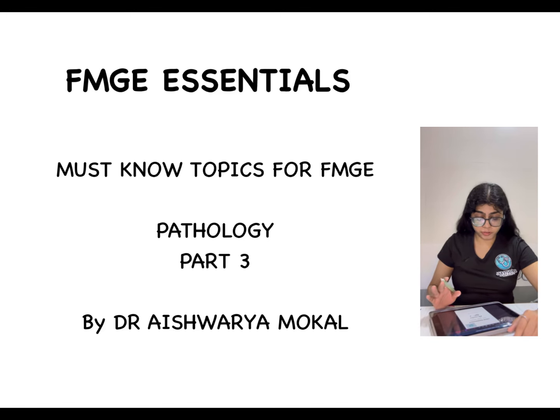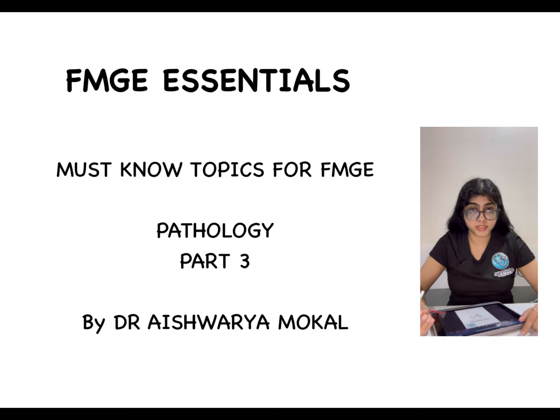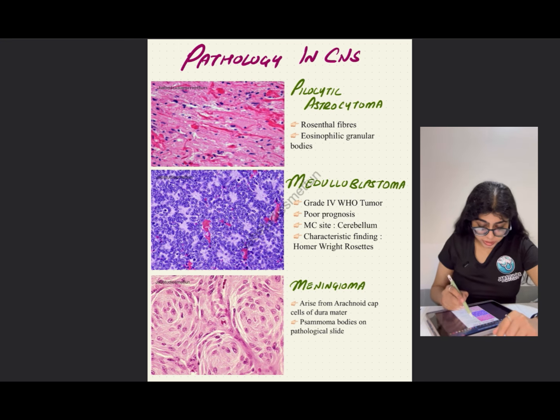In this video, we'll be looking at some particular pathologies in different organ systems in our body. The first one is pathology in CNS. The first tumor that we'll be looking at is pilocytic astrocytoma.